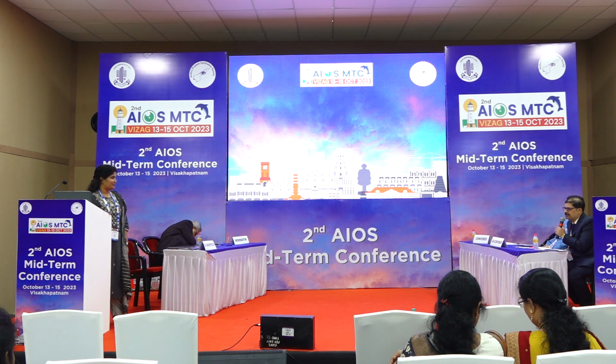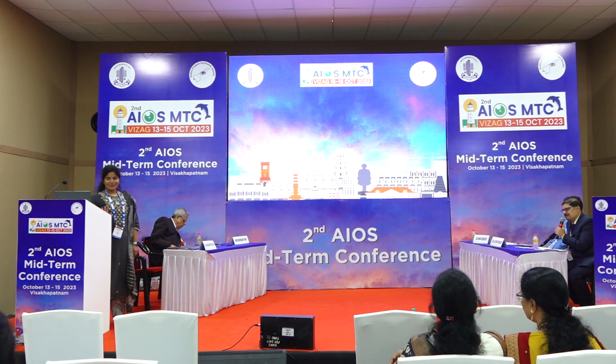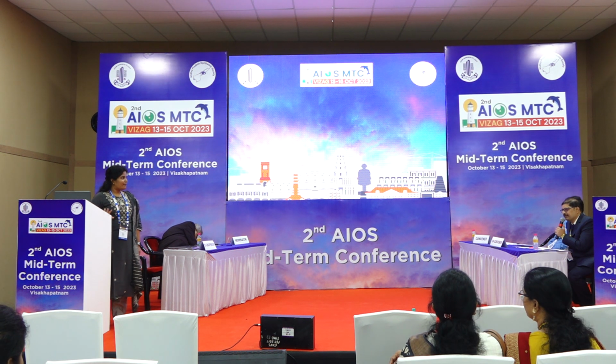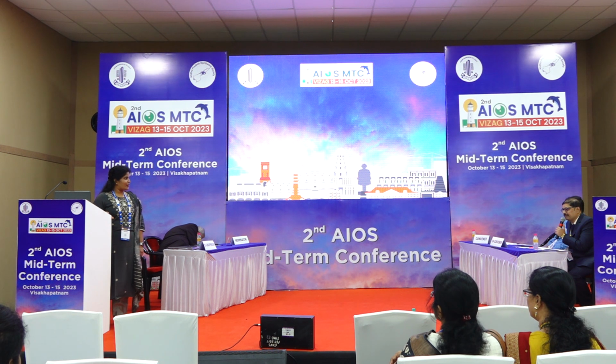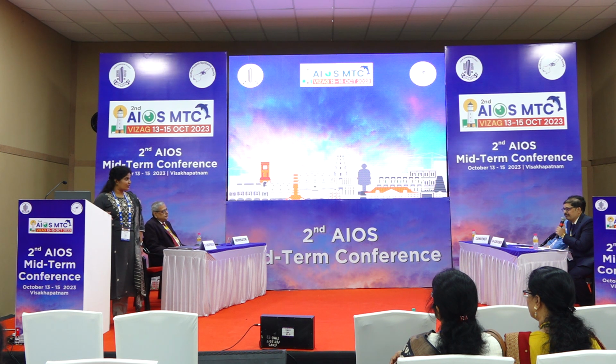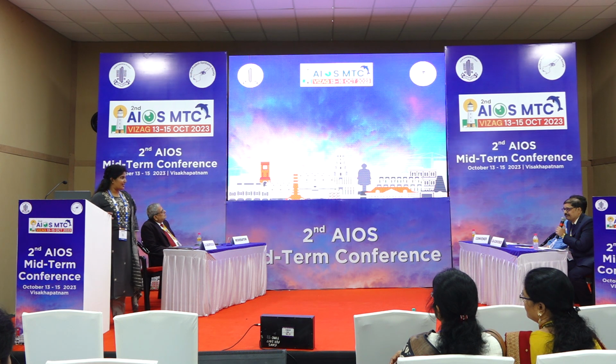And what is the limitation that is common? The limitation is that in Barrett's we want the AC depth, which is better measured by optical biometry. But even with immersion ultrasound biometry, you can get the AC depth, because in dense nuclear cataracts, optical biometry cannot analyze the AC depth and axial length.